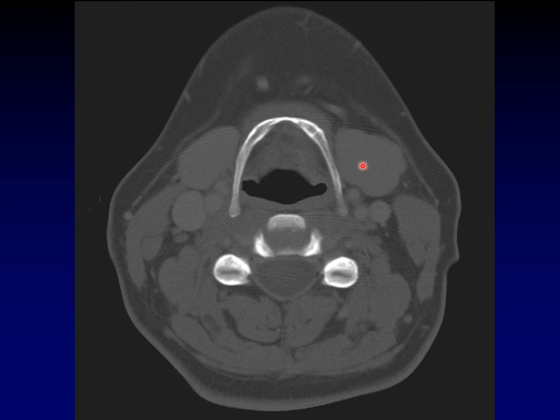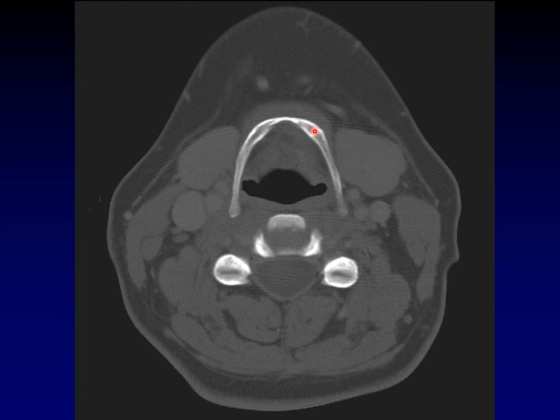Notice again this nice smooth arch that defines the hyoid bone. In contrast, this is the thyroid cartilage — there's no smooth arch out front. This thing comes to a point, so we describe the thyroid cartilage as steepled in front, rather than smoothly arched. You might ask why you'd need help distinguishing a bone from a cartilage — isn't the bone going to be much more dense?